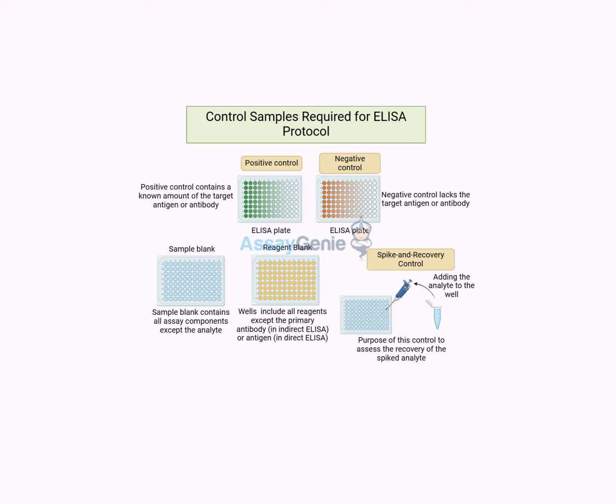Wow, so the positive control is like the gatekeeper? Yeah. It's making sure that the test is reliable before we even look at any patient samples? Exactly. What about the negative control in this situation? So the negative control would be a sample that we know does not contain those HIV antibodies, and this helps us rule out any false positives. If we see a signal in that negative control, it means something's interfering with our assay.